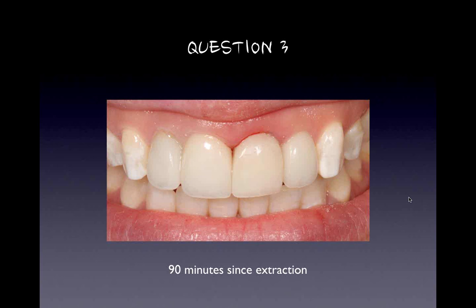It's an Omnivac 020 material. It's clear, and because it's clear, you can see the composite. You can see if there's any voids. You can take it off, put it back on. So we use that much better than PVS material. We do use the PVS material when we're doing our Luxatemp veneers. So we'll use our PVS material for Luxatemp veneers, not for composite bonding.